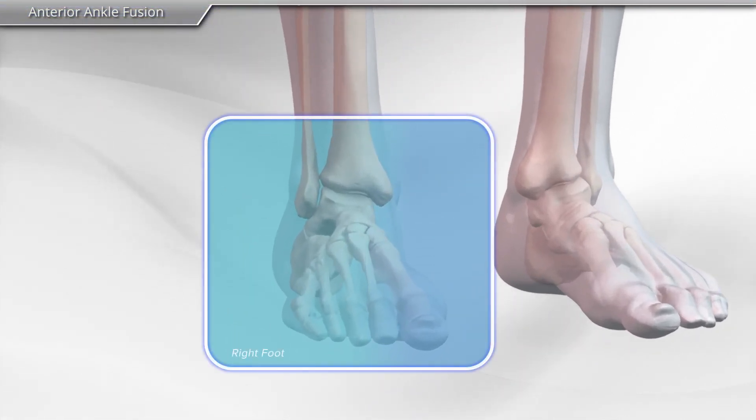In this animation, we will demonstrate an ankle fusion for arthritis using the anterior ankle fusion plate.